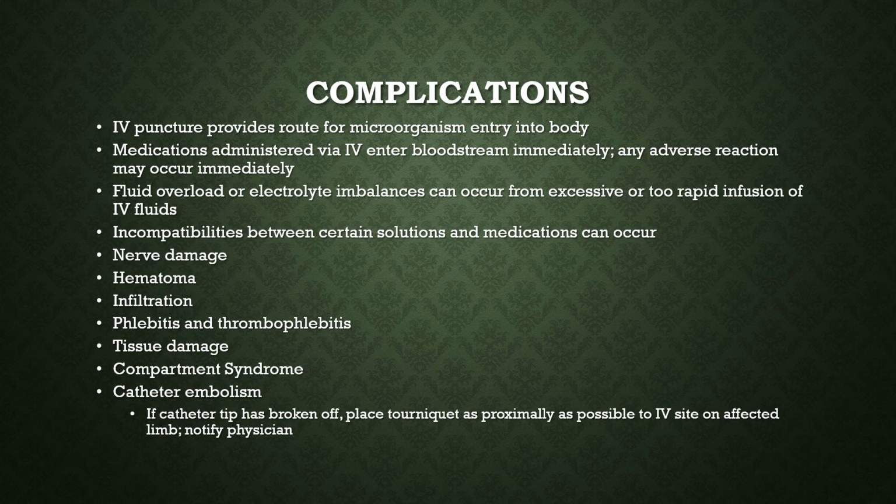Catheter embolism. So your little hollow cannula or catheter or whatever you want to call it that's in the skin, it's attached outside the skin to a little plastic hub that the tubing goes in. When we discontinue an IV, we should always look and make sure that little cannula is still attached to it. And I had always said to students, in my, at that time, 35 years as a nurse, we always check the catheter, but I've never seen a catheter tip not be attached to the IV. So it almost got to the point where, like, why do we do this?